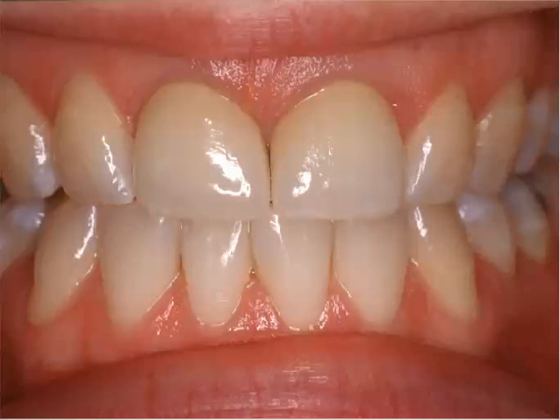What are the goals we strive for when we talk about impression technique? This was a young lady I did about 7 or 8 years ago, at least the initial placement of the crowns, the porcelain fused metal crowns on 8 and 9.